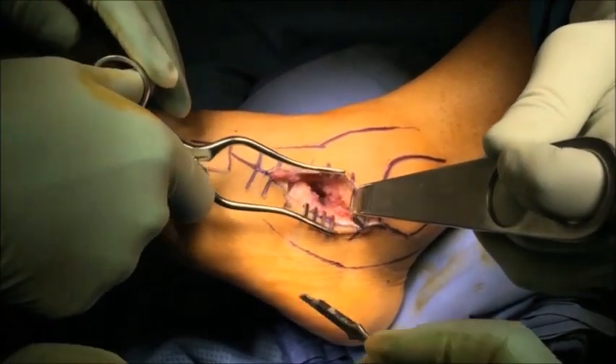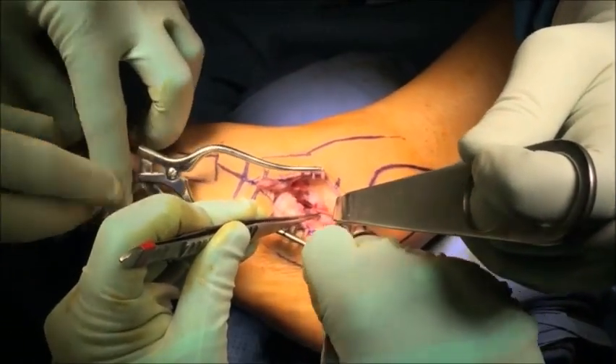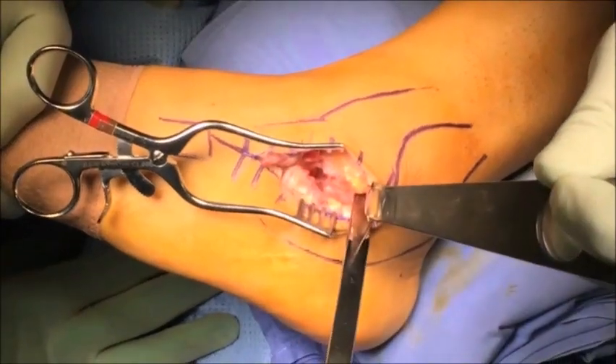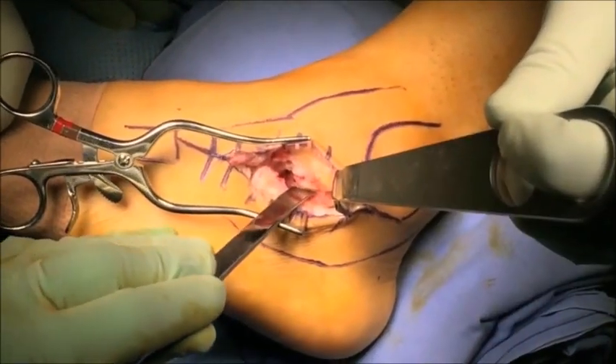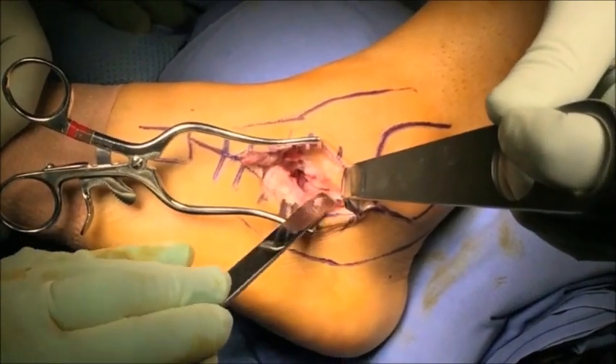The use of self-retaining retractors is helpful in maintaining the exposure of the surgical field. The subtalar joint is then identified and, as you can see, it's quite a tight space to work in. Using a sharp osteotome or chisel, the lateral half of the posterior facet is denuded of its cartilage.